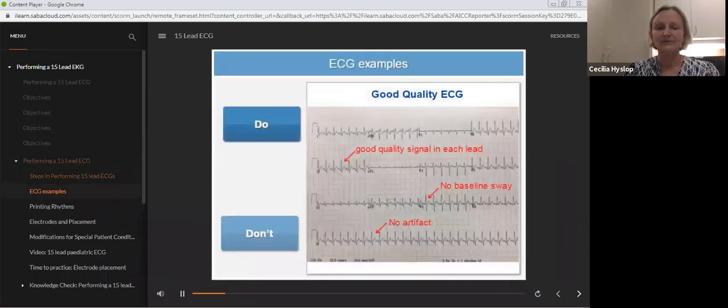As we take you through this iLearn, we're going to look at specific aspects of 15 leads and also show you some videos as well. There's some quick check questions, so we'll answer the quick check questions as well.